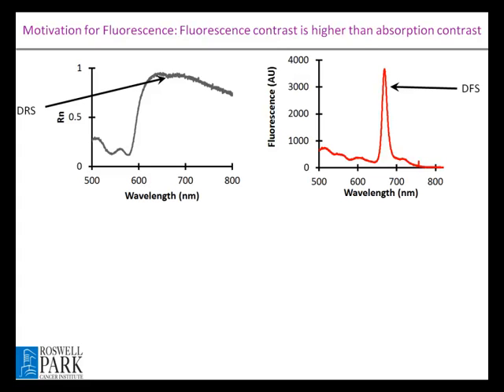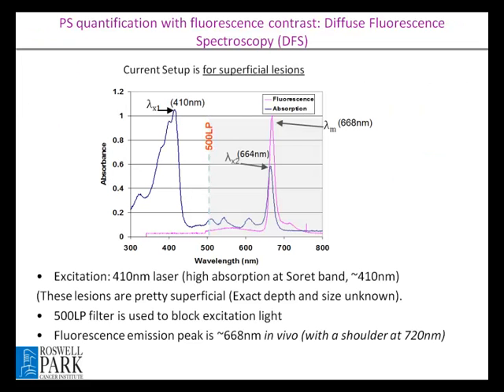So I'm trying to motivate you for the fluorescence spectroscopy. It is a very nice signal we are getting from the HPPH, this drug, with very high contrast, so we also measure the diffuse fluorescence spectroscopy for this purpose, quantification of the drug. So for this purpose, we excite.